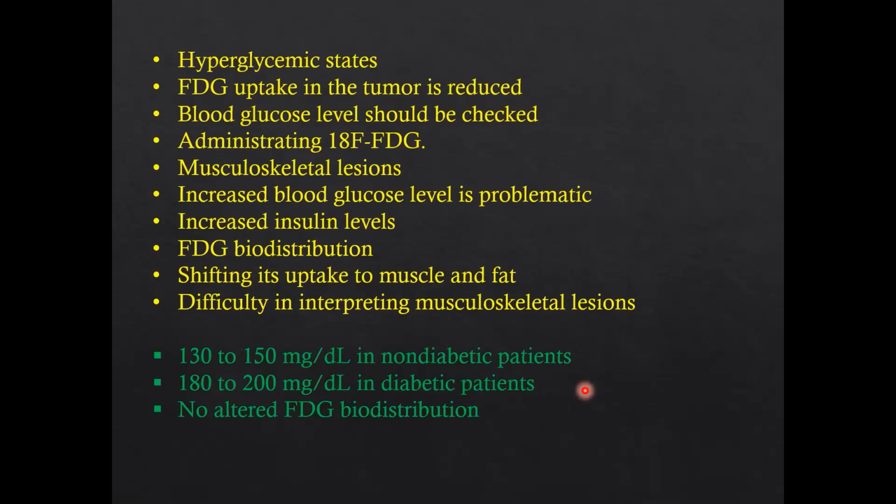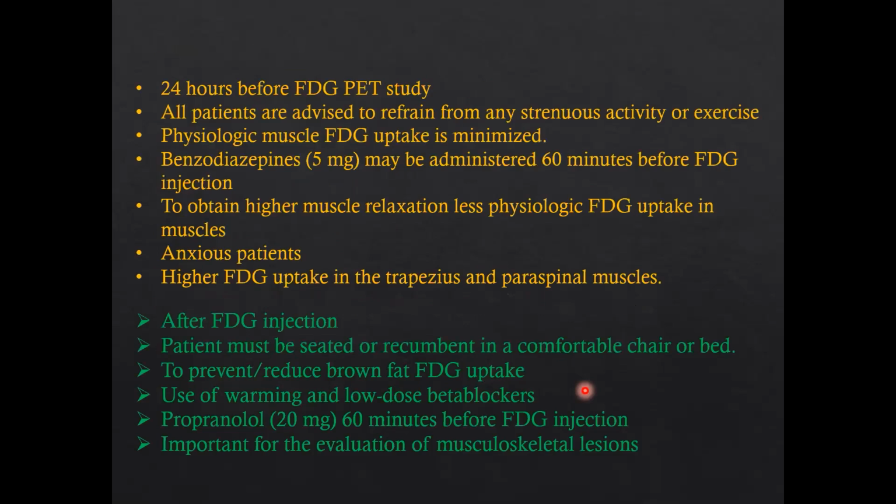So coming to certain facts, 24 hours before FDG study, all patients are advised to refrain from any strenuous activity or exercise, because any sort of physiological muscle uptake should be minimized. If it is present, then it will be difficult for the evaluation of musculoskeletal pathologies.